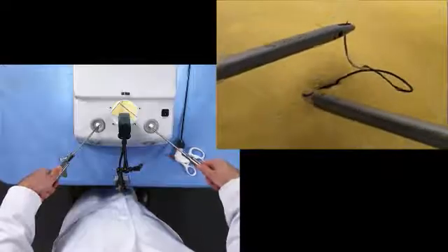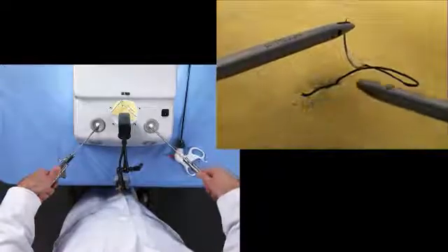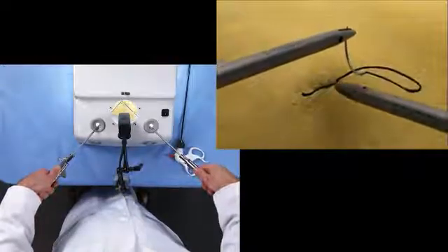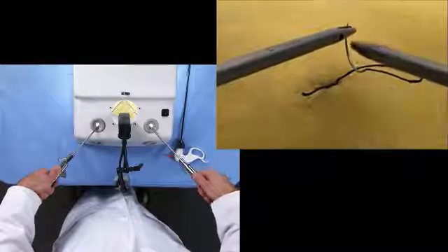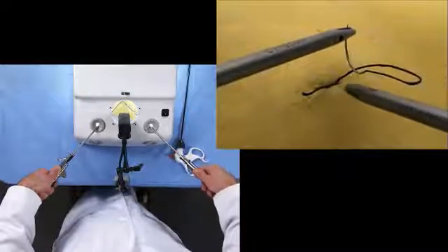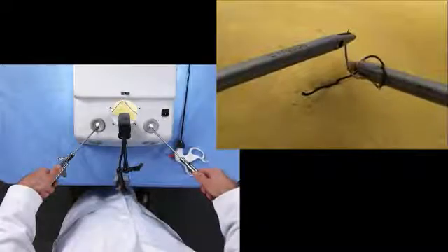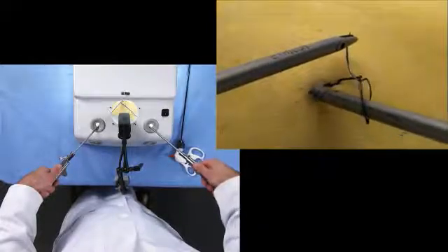The tag is now to the left of the knot at the 7 o'clock position. The needle will now be just to the right of the knot. We'll do a counter-clockwise rotation around the needle to grasp the tag.